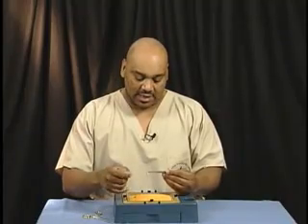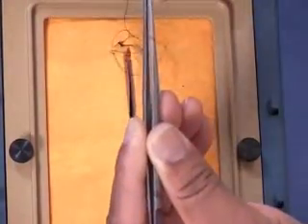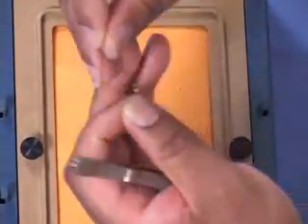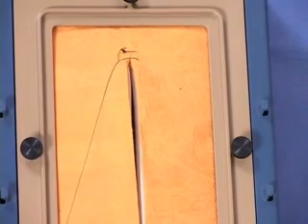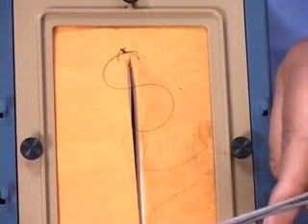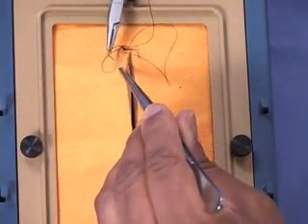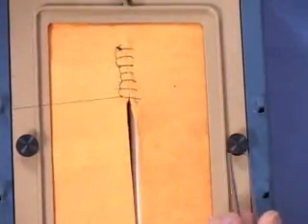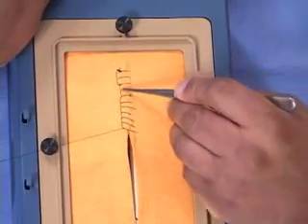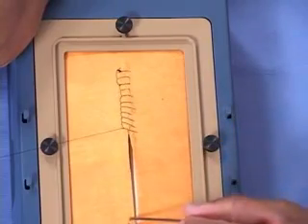The key to the running locking stitch is to retrieve your needle always through this loop. Now, when you pull up, you will see the pattern that is created. Our goal now is to duplicate that pattern all the way down the wound. Notice the pattern that is created. We would continue this stitching pattern over the whole course of the incision.